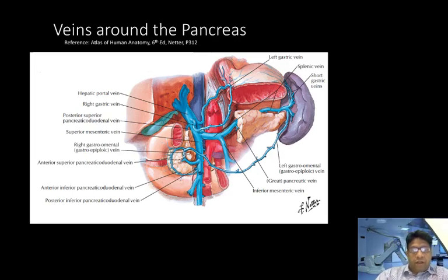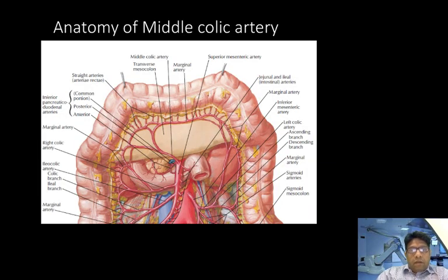Dissect relatively free of fear of damaging any vessels. Okay, now this is very important, in that although you might look at the CT scan preoperatively and assess that it's resectable, you may find at operation that it is not, and instead some type of a bypass procedure, a palliative bypass procedure, is required. So this is one of the first steps: looking for mesenteric secondaries, omental secondaries, peritoneal secondaries, peritoneal seedling, liver metastases would all be indications that you should not proceed with the full Whipple's pancreaticoduodenectomy.